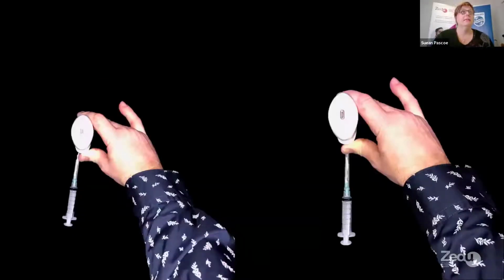So here's an example of that. If you are just a tiny little bit off, and it could even be a smaller degree than this really, but I've exaggerated a little bit here, that will mean you won't be able to see your needle. You have to make sure you get right in behind and make sure everything's lined up. So taking that extra 20 seconds to take a bigger breath and to line up exactly means that you're going to get better success rates, especially for that in-plane approach.